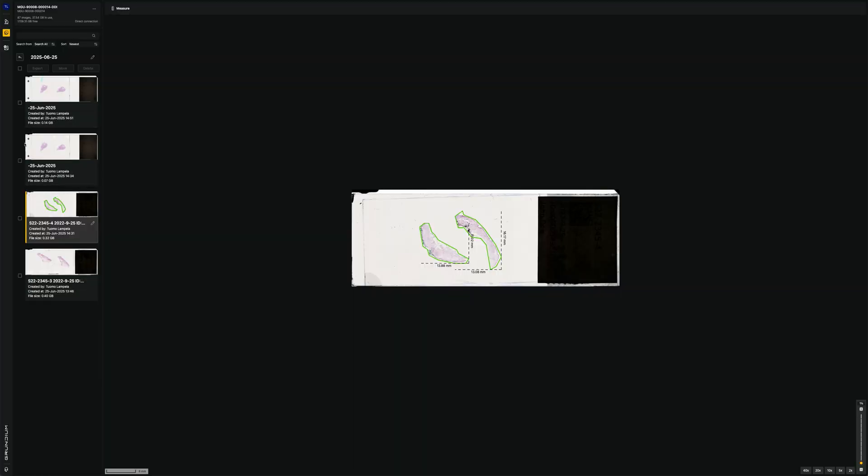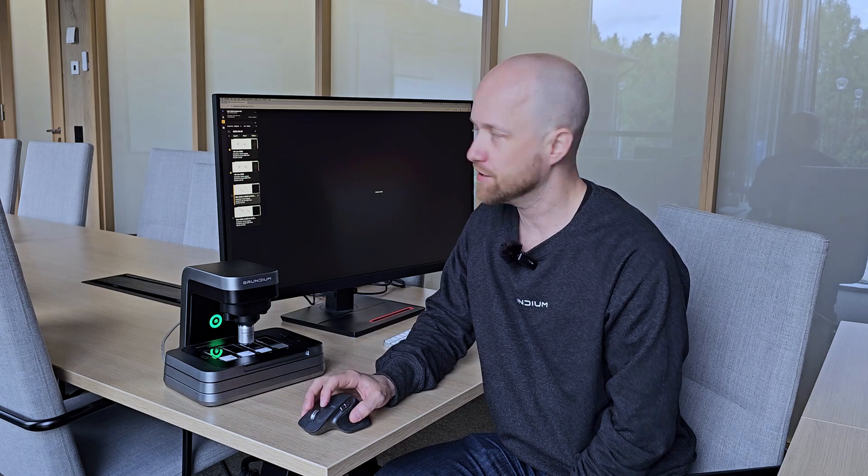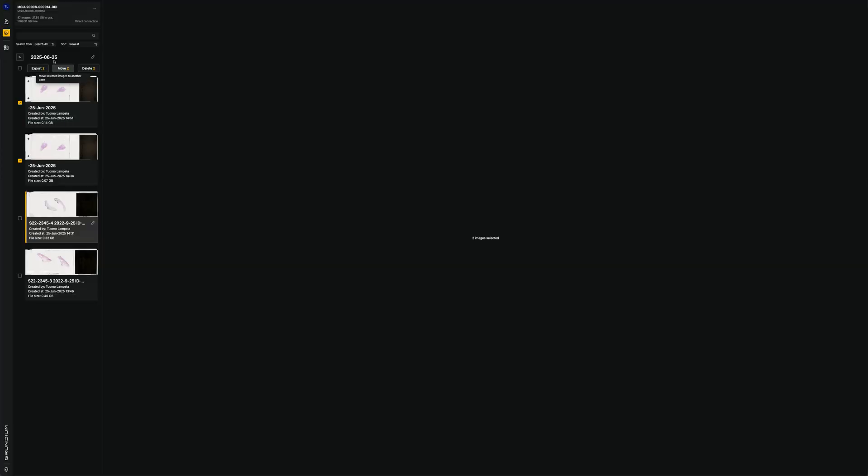And then we can also move the images from cases to other cases. So that's easy organization. And we can also rename case names. These features provide a lot more easy organization to your image management.